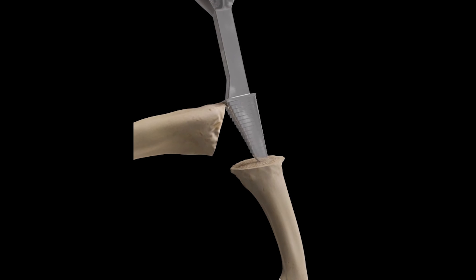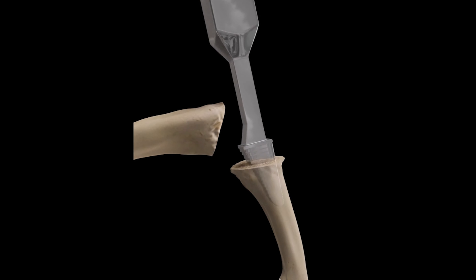Joint replacement of the metacarpophalangeal joints is used for the treatment of degenerative or rheumatoid arthritis. Silicone implants can be used to restore mobility to the MCP joint.